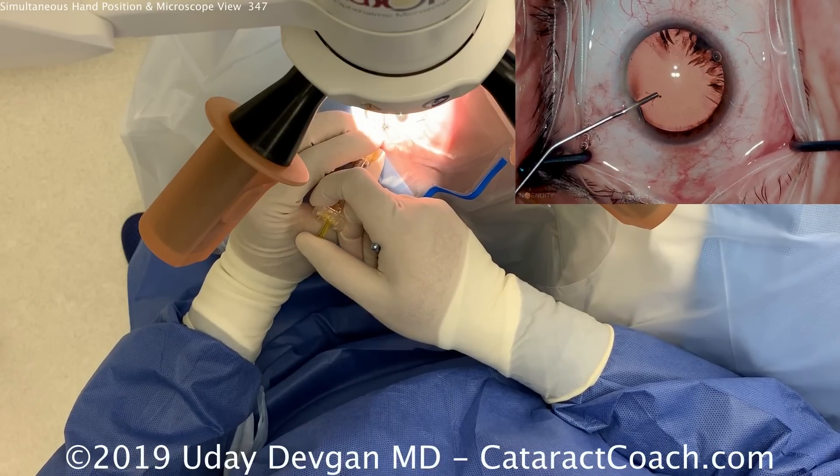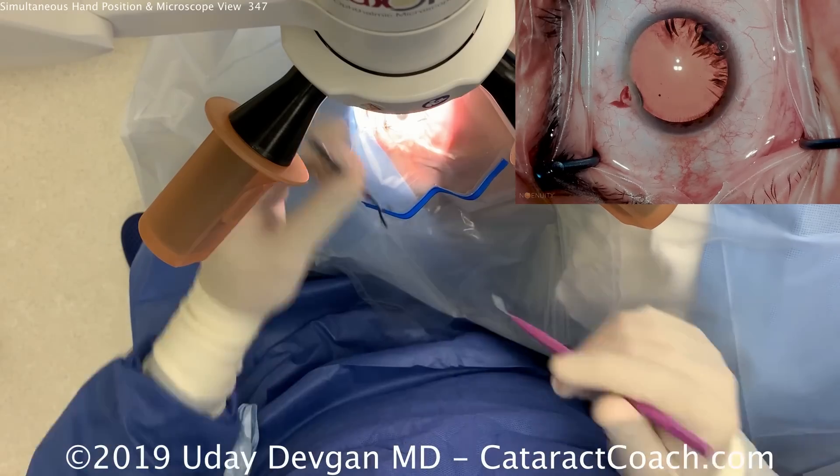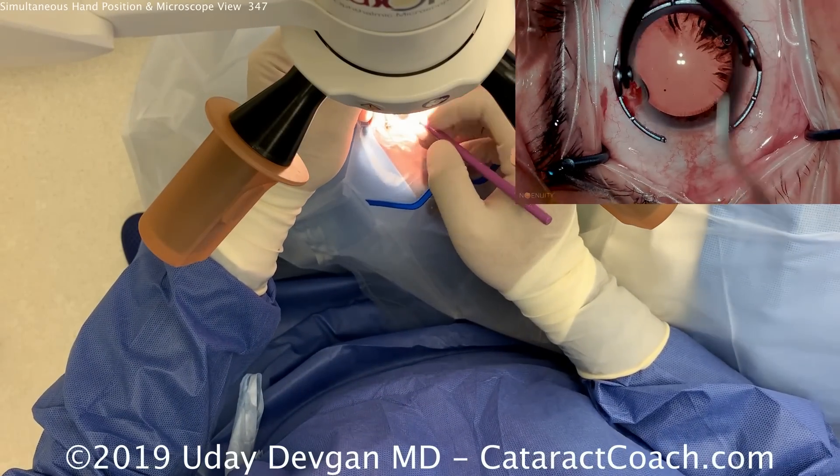The right hand's on the plunger. Look what's inside my right hand — I'm palming that fixation ring. Now I switch the fixation ring to the left hand.